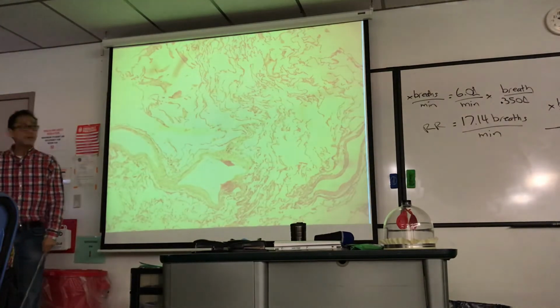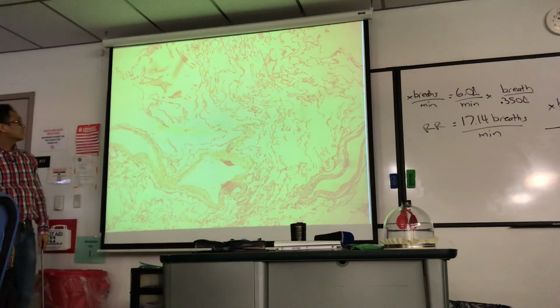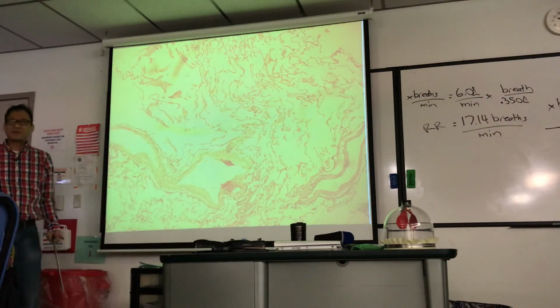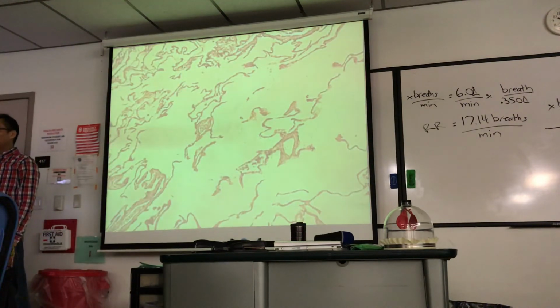Emphysema lung. Looks pretty messed up. Huh? There's no alveoli. There's a lot of fibrotic scar tissue. I mean, can you imagine ventilating this? It doesn't look like anything. There's no organization. Terrible. It's just pathologic tissue.